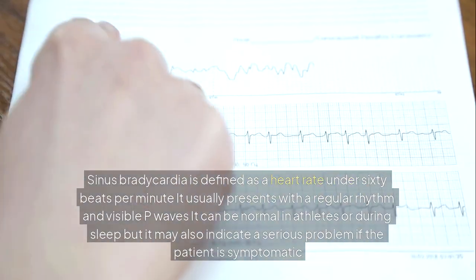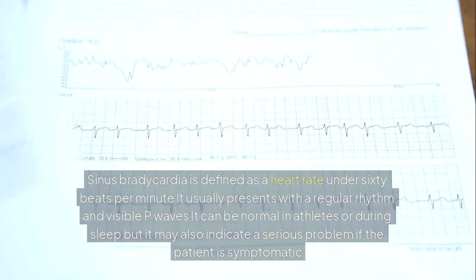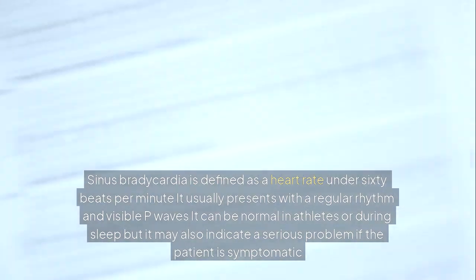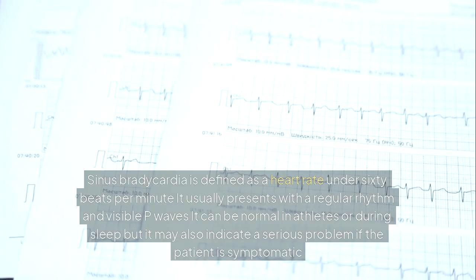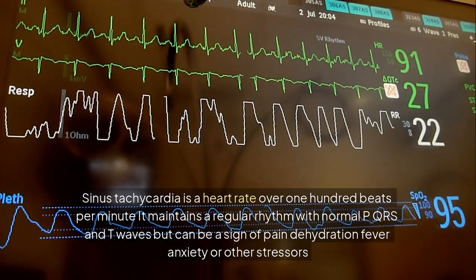Sinus bradycardia is defined as a heart rate under 60 beats per minute. It usually presents with a regular rhythm and visible P waves. It can be normal in athletes or during sleep, but it may also indicate a serious problem if the patient is symptomatic. Sinus tachycardia is a heart rate over 100 beats per minute.